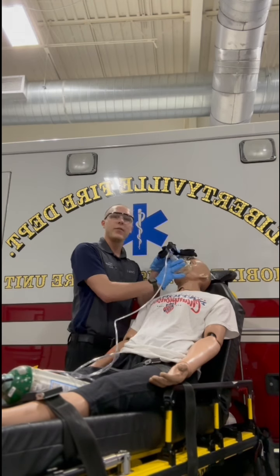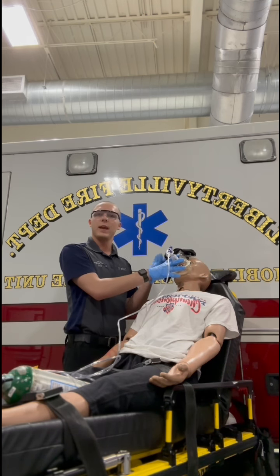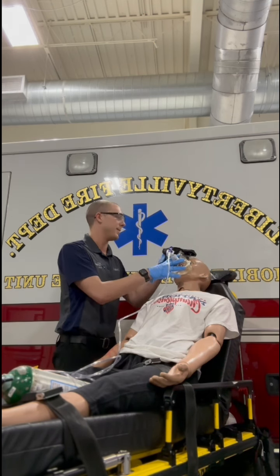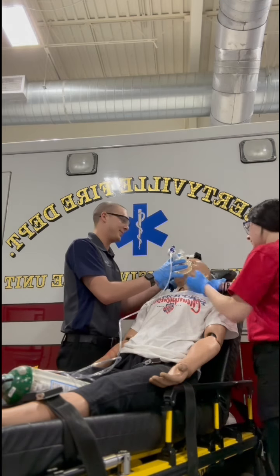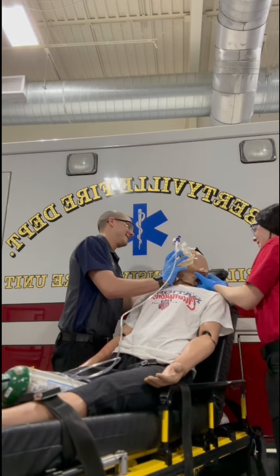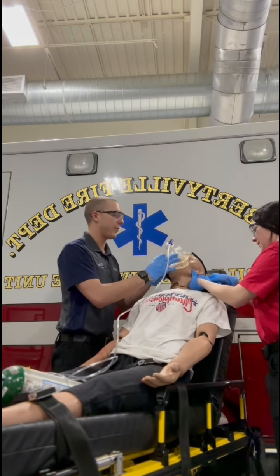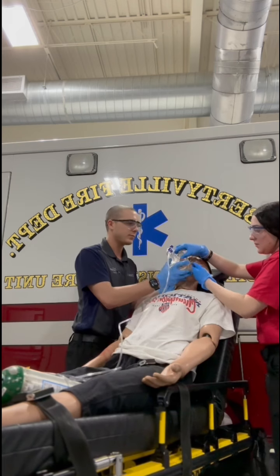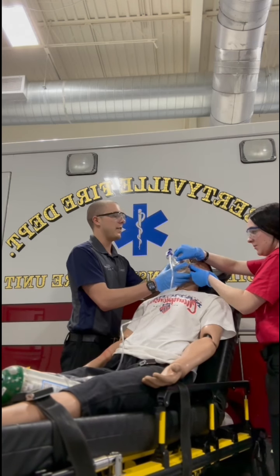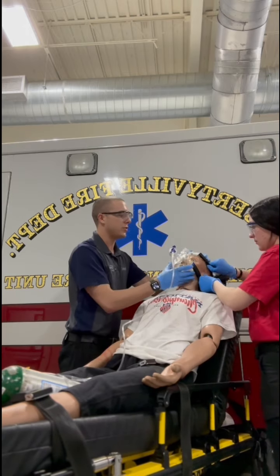So we have the mask on the patient's face. We're coaching them through it, asking them how it feels. If it feels all right, we're going to go ahead and secure it. My partner here is going to help. You got that side? So with these masks, there's about 4 connections. And then the forehead piece also moves, so play around with that if you get a chance. Making sure it's all snug.